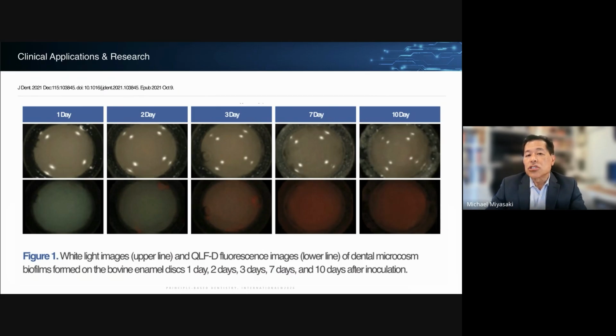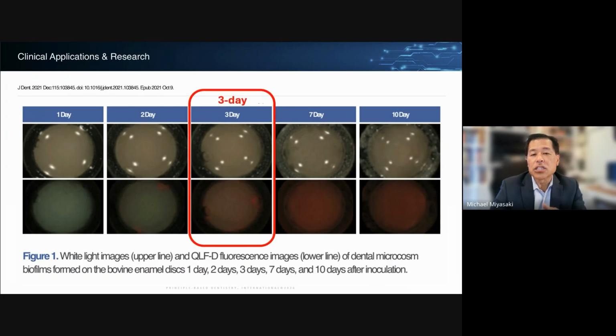But with this, it's just light. And so it's very convenient for the patients. And it's not going to just show early plaque. It's going to show the biofilm that's more mature at 3 days or older. So that's what you see in this study, where they were looking at different days of biofilm age.